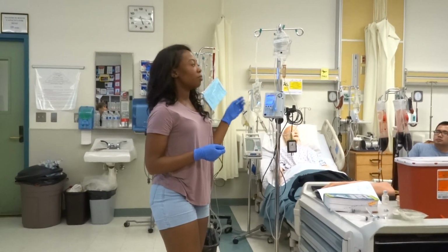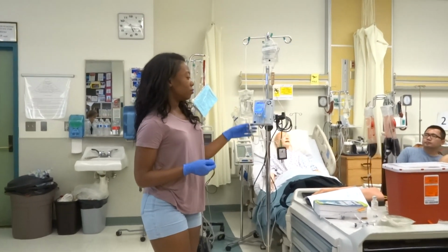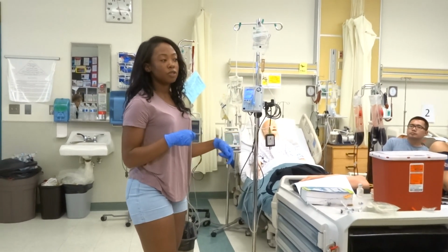How long is primary tubing good for? 72 hours. So that should be one of your first assessments, really. If the patient already has it, check the date, and also date it yourself if you just changed it, right?